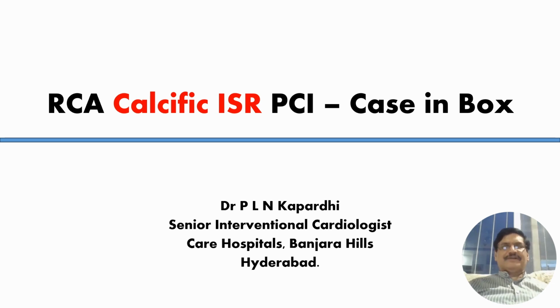I am Dr. PLN Kapardi, interventional cardiologist of Care Hospitals, Banjara Hills, Hyderabad. Today I am going to present a case of in-stent restenosis of the RCA with calcific in-stent stenosis, treated with angioplasty.